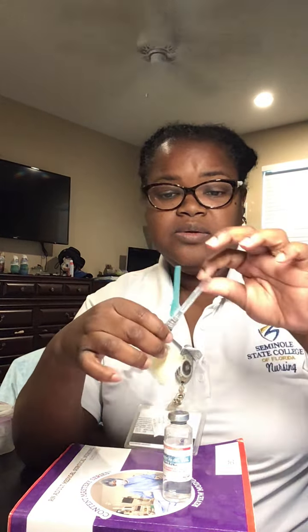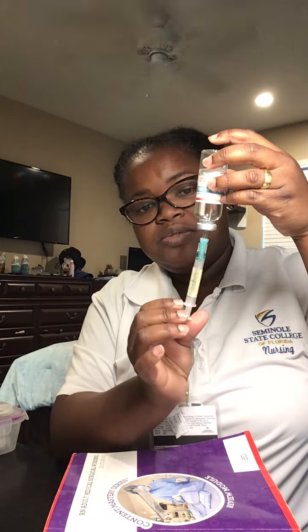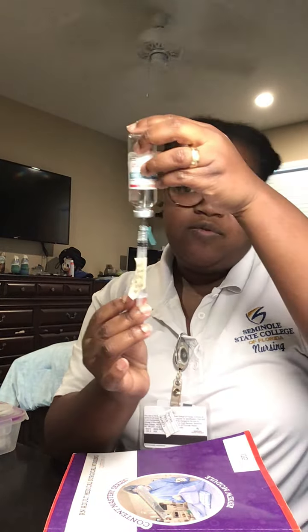I open in butterfly motion. Okay, I'm going to put my cap here. It has to be air to air. I'm going to just use 0.5 ml of air, injected into my vial. Inject the air, switch. I just have to catch the 0.5 I need.